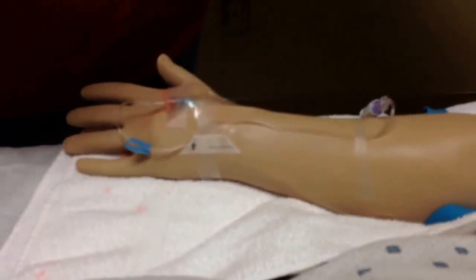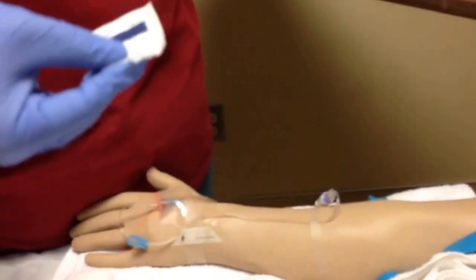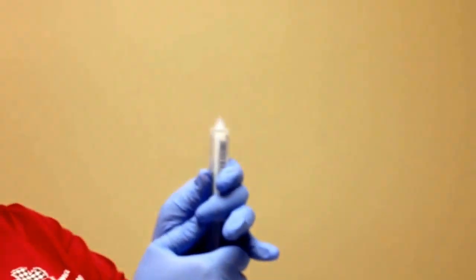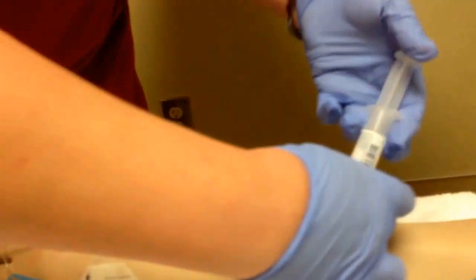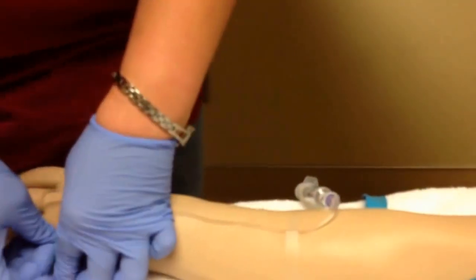Let's say it's been a few minutes and we need to flush this port again. If I need to access this port now, I need to get an alcohol prep and my saline. If the saline has air in it, I'll pull back and push the air out. I'm going to clean my port really well with alcohol to remove any contaminants, access the port, unclamp it, and flush with generally about 3 milliliters of saline — just enough to keep the line clear.